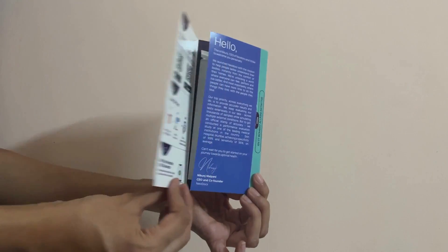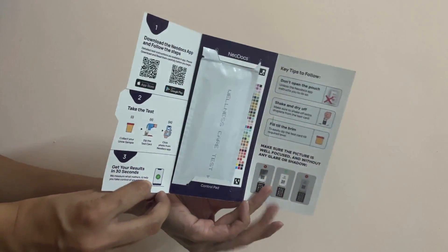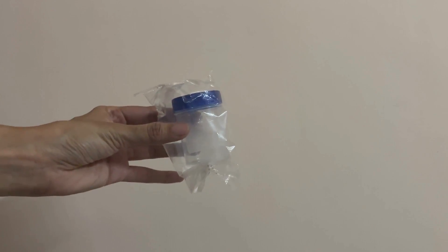Hi, thank you for choosing the Neodocs urine test. Watch this video for an easy guide to using the test card. Your Neodocs kit includes the packaging with instructions, a test card pouch, and a urine sample container.